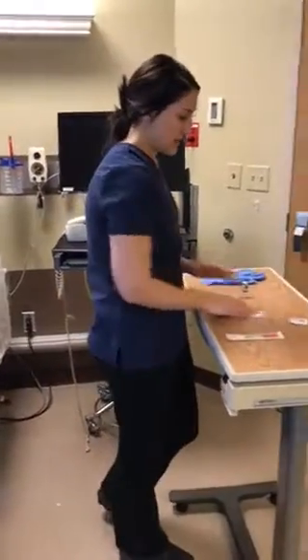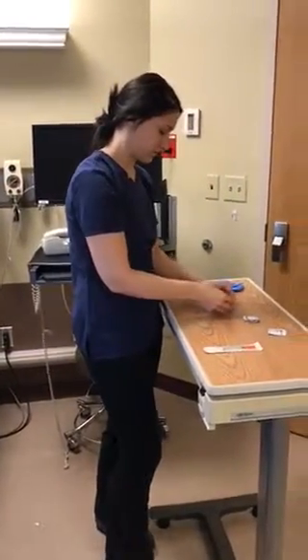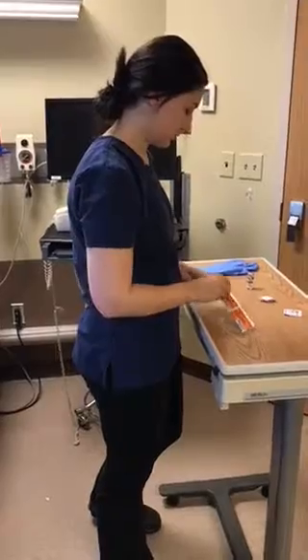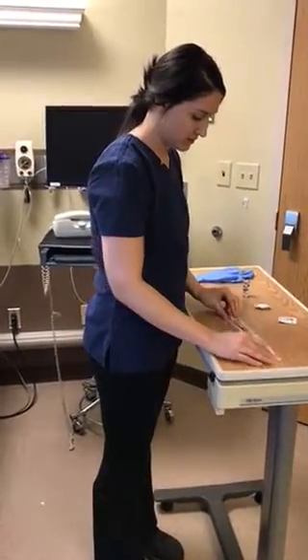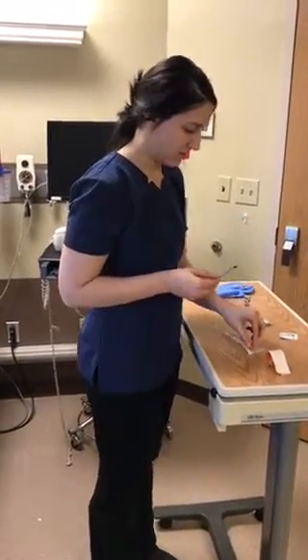The next thing I'm going to do is clean the top of the vial with the alcohol pad. And while that is drying, I'm going to prepare my needle. The inside of this is going to be my sterile field. I'm going to take that cap off.